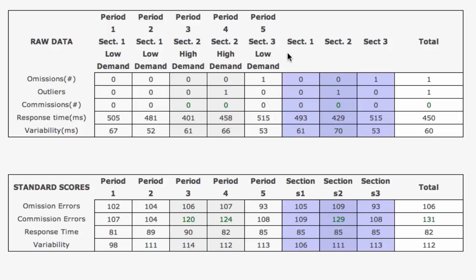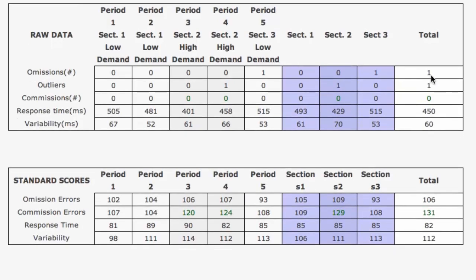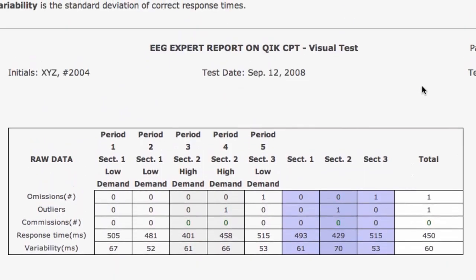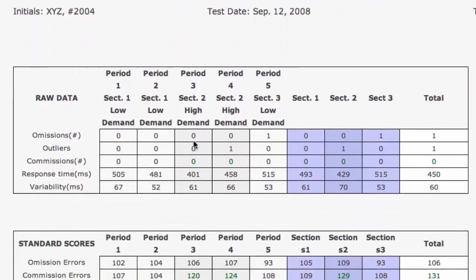We take that same data and just process it differently. Period 1 and period 2 combine to be section 1, so we can look at the data as a section or as two periods — it's the same exact thing. So we're going to see the 505 and the 481 combine to be on average 493 here when combined into one section. The average of all five periods taken together or as three sections averages out to the same thing — this 450 response time. Here we see that one omission error in the low demand fifth period, and that one outlier was in the second high demand, reflected here in section 2 and in the total.